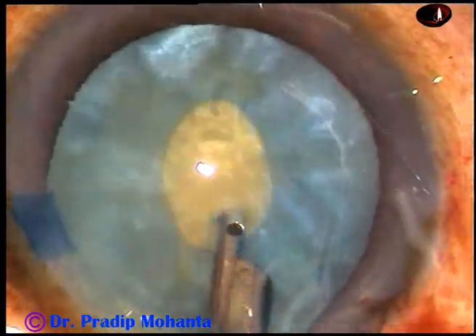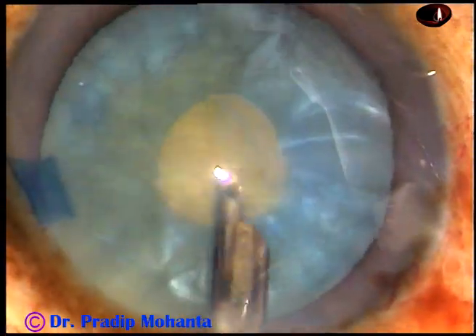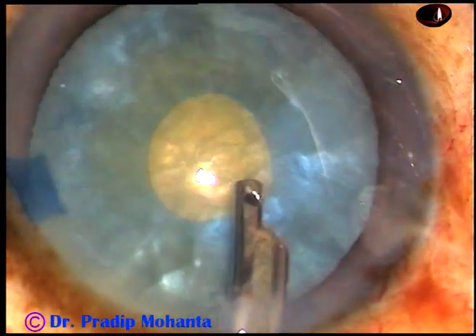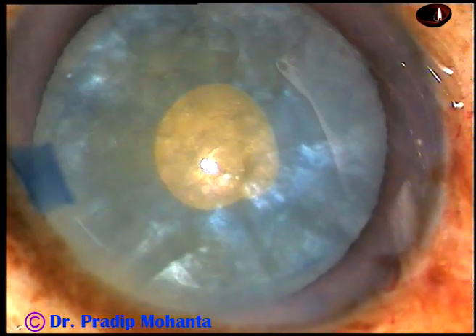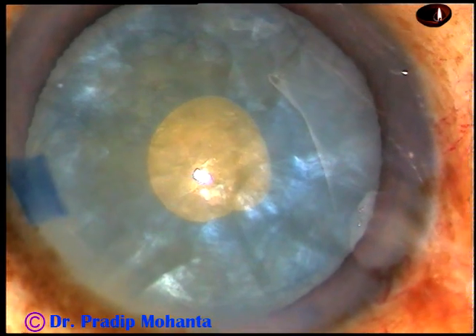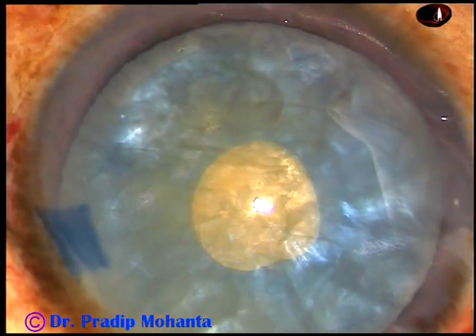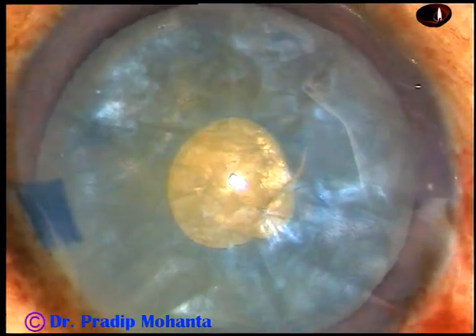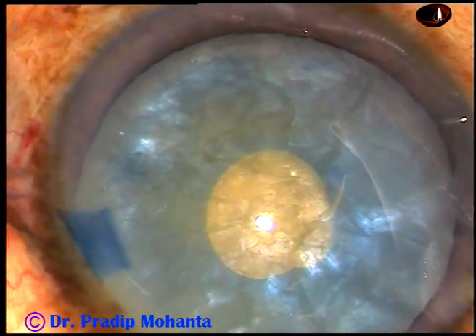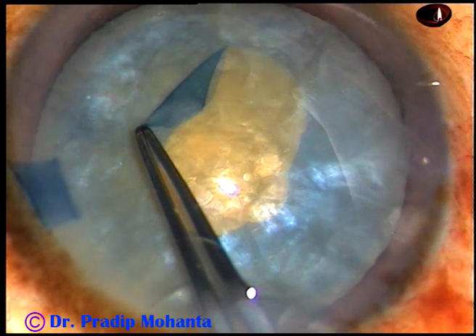And the next steps — the surgery is very easy and predictable. I am using a 23-gauge Simcoe to remove the cortical lens matter. And now, 2% HPMC is injected again. And then, with the help of a Vannas scissor, a small nick is made like this.